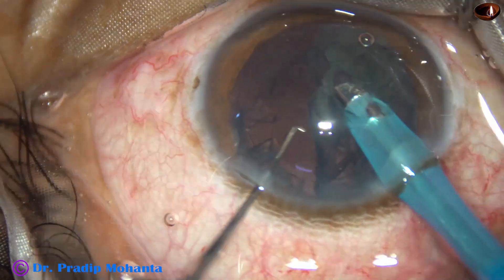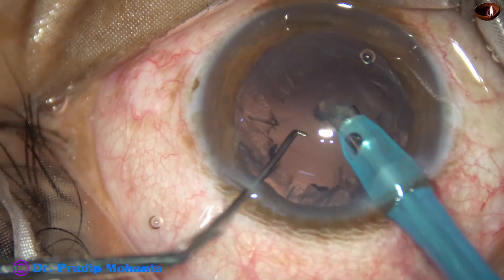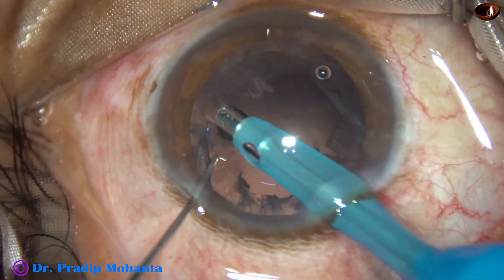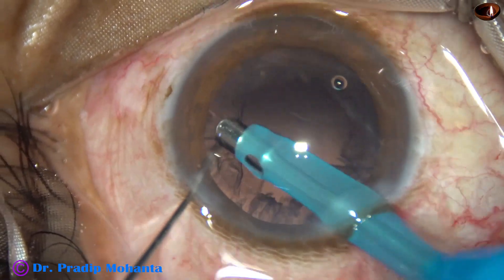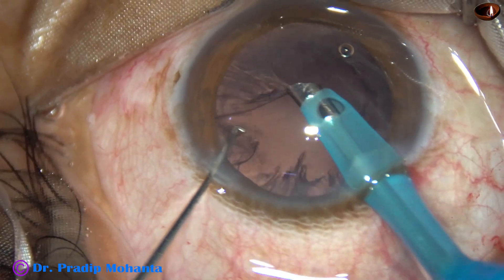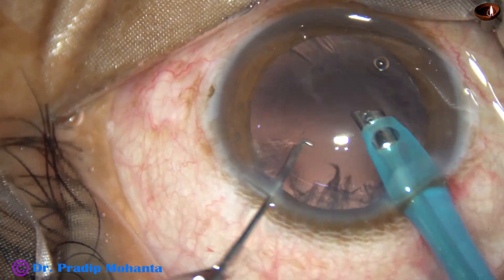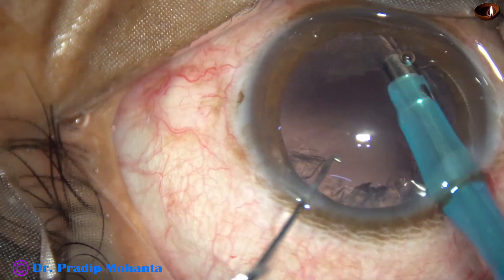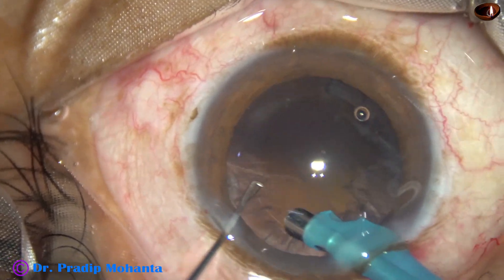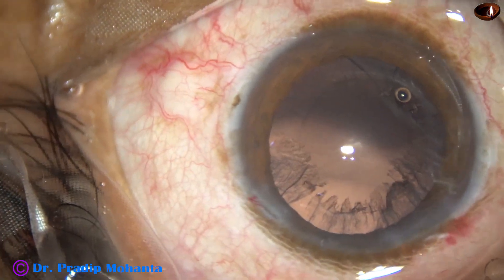The other small free piece comes to the tip and is emulsified. The hemi-nucleus sheet also easily comes to the aspirating tip — the aspirating port of the phaco needle — and is easily removed. In this case, I tried to remove a part of the cortex with the phaco needle itself. Vacuum was 250 and flow rate 25. After removing a portion of the cortex, I came out, wanting to use a safer instrument for this.